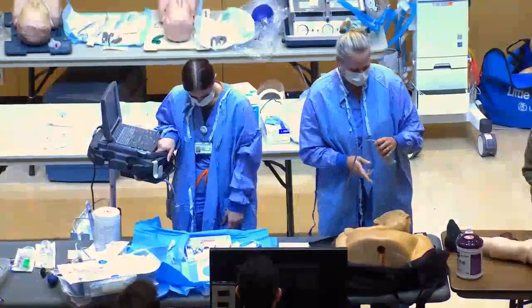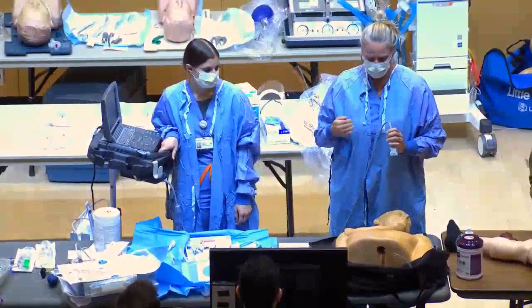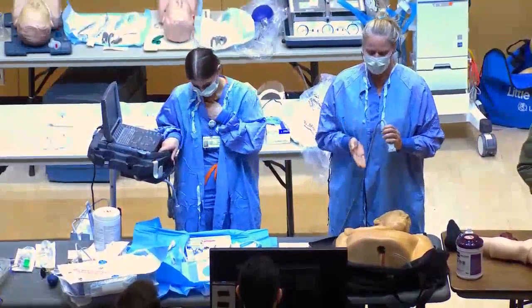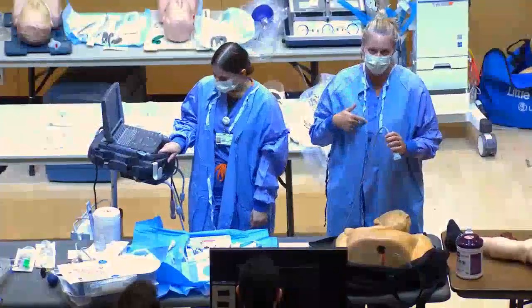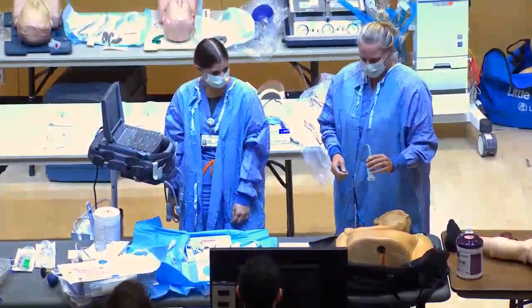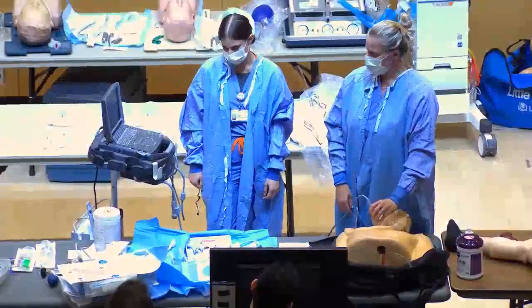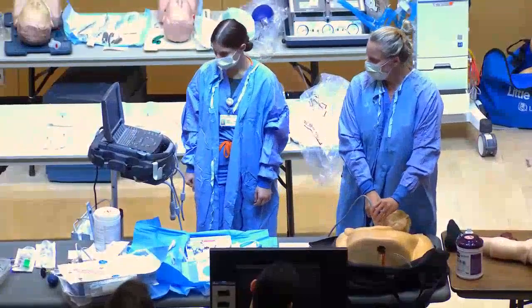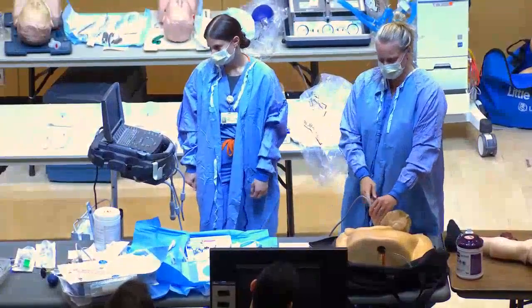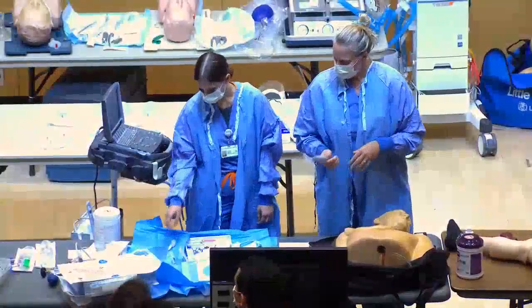I'm going to access the right internal jugular because it's generally the easiest and has the best direction — it goes straight down into the SVC/right atrium area. Before going fully sterile I'll check the site, sometimes pressing with my finger to confirm the vein compresses. Then I start getting my kit set up.